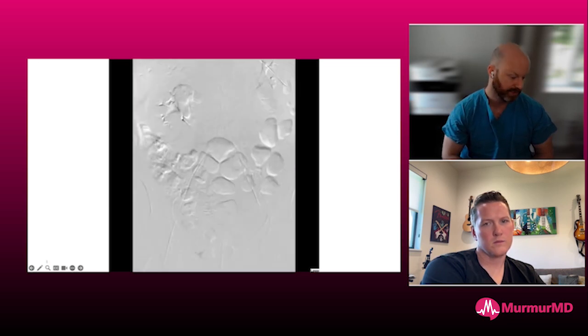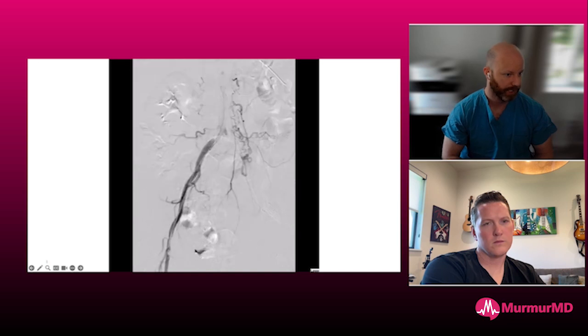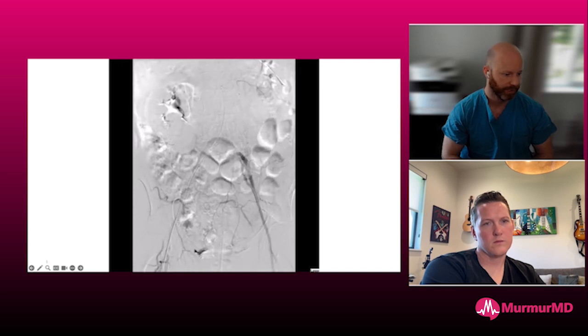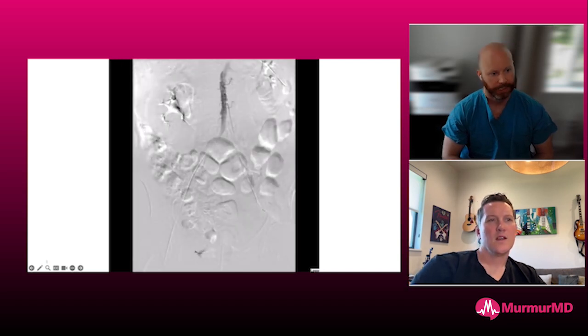If they do not become increasingly pulsatile, that gives us significant pause, and those are people that we really think about switching to our repositioning sheath and sending upstairs to recover with the Impella for a day or two or more.